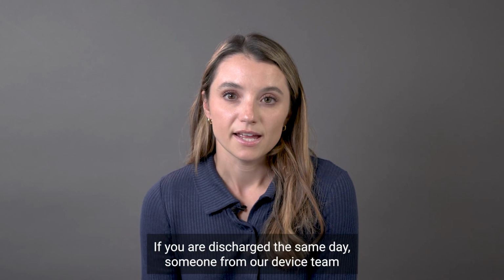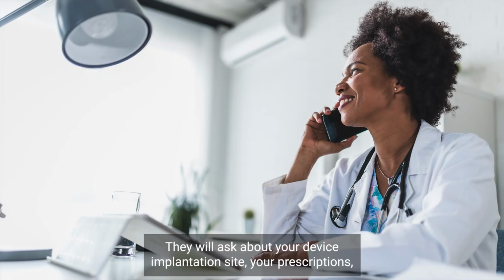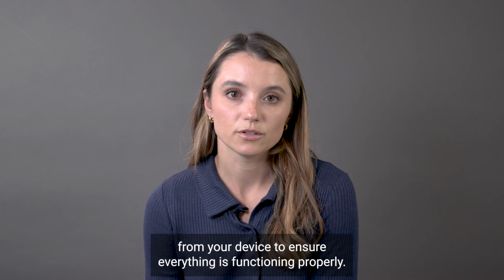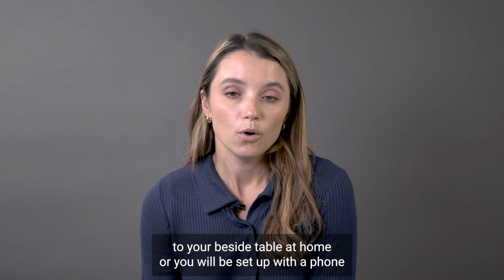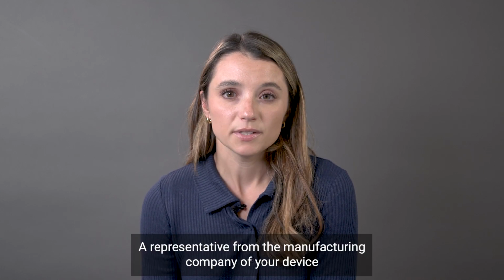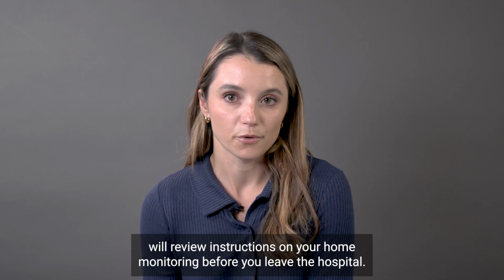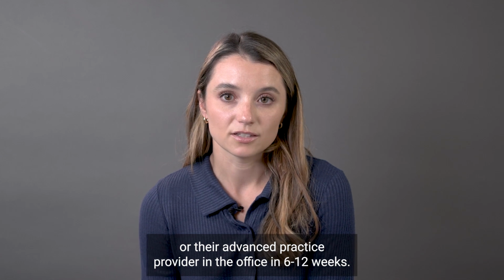If you are discharged the same day, someone from our device team will call you the following day to check in and see how you're feeling. They will ask about your device implantation site, your prescriptions, and will review a remote transmission from your device to ensure everything is functioning properly. You will be discharged home with either a remote monitor to keep plugged in at your bedside table at home, or you will be set up with a phone app that is able to monitor your device. A representative from the manufacturing company of your device will then review instructions on your home monitoring before you leave the hospital. You will then have a follow-up visit with your doctor or their advanced practice provider in the office in 6 to 12 weeks.